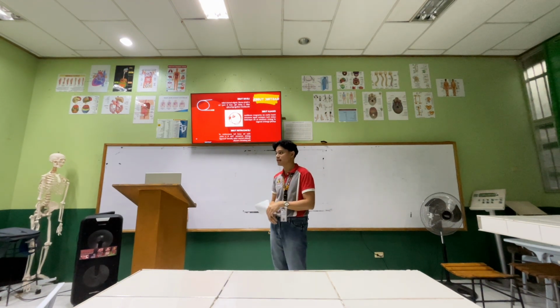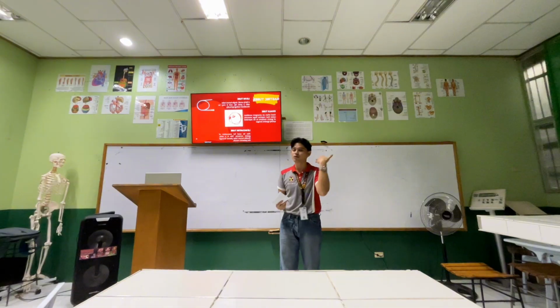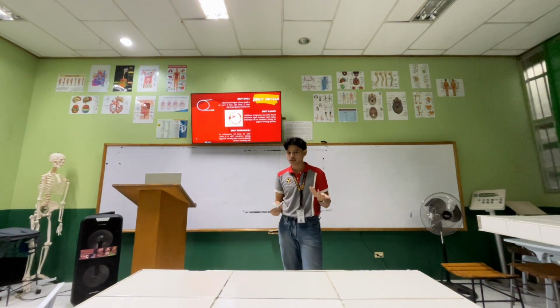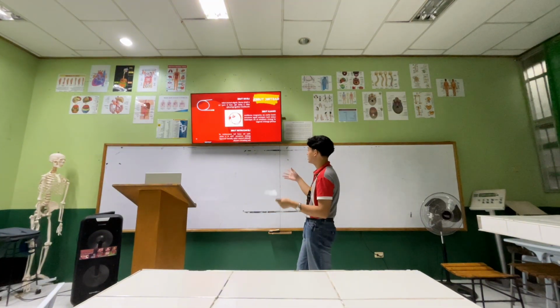Gastric tubes and abdominal catheters are used for giving nutrients to our body and removing things from our body. Like, if the patient or the person is not able to swallow, that is when we will use these gastric tubes.